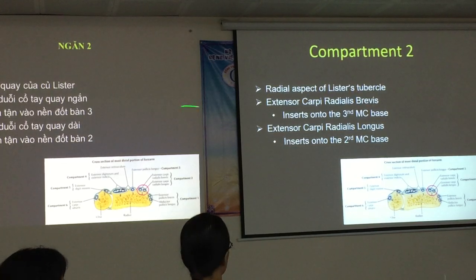And this houses the extensor carpi radialis brevis and extensor carpi radialis longus.